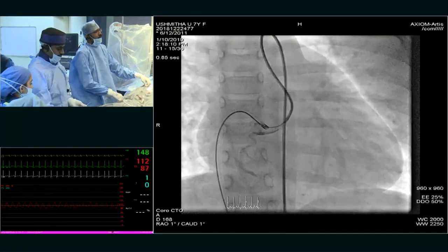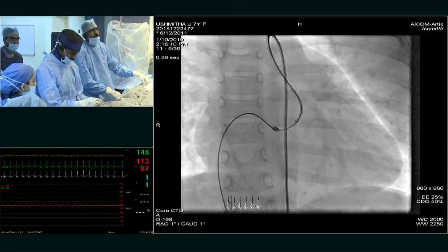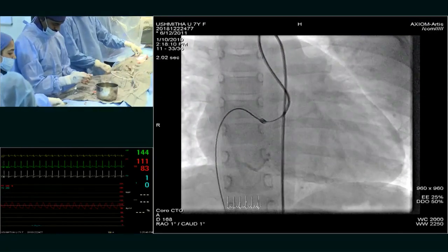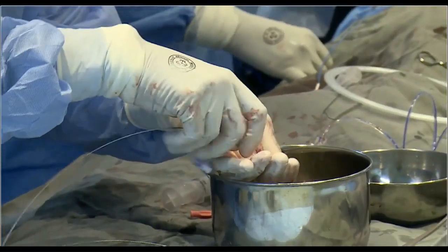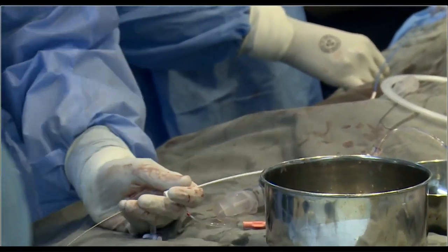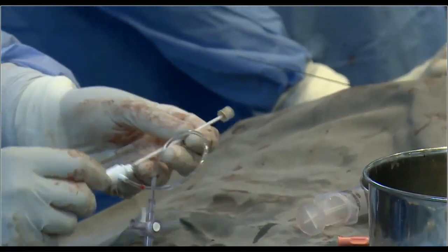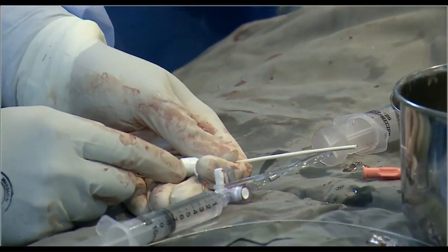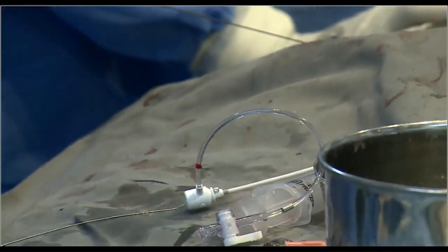Now I want to know from the floor — what was your thought process, what device? Get me a 5 French Lifetech PDA cable.